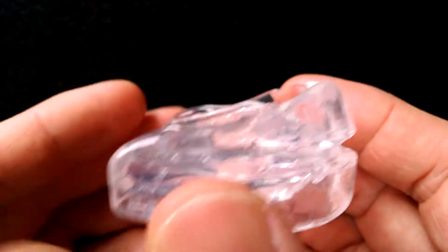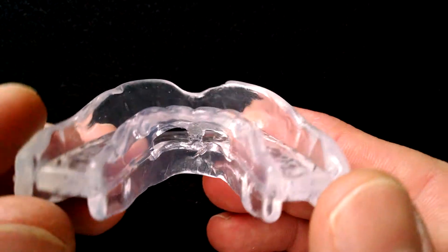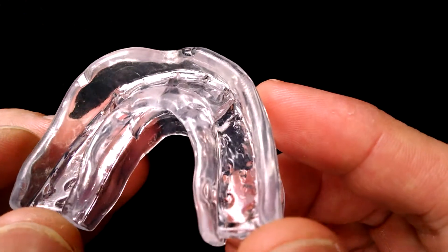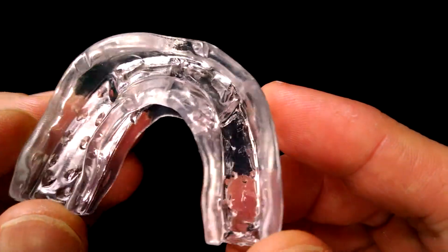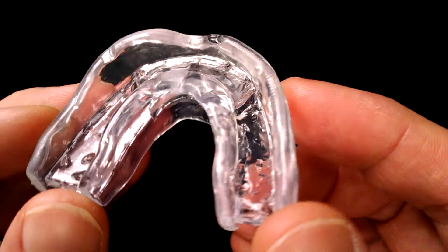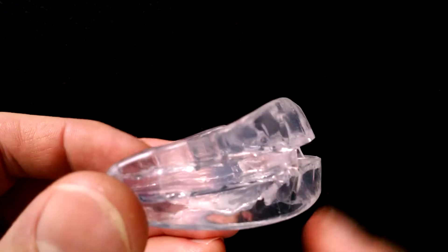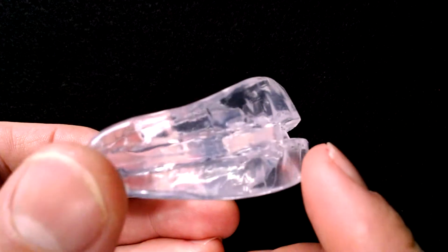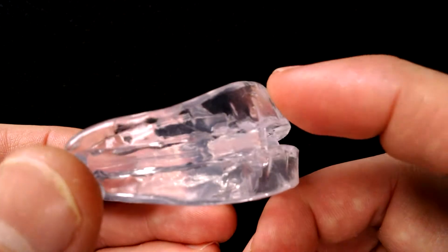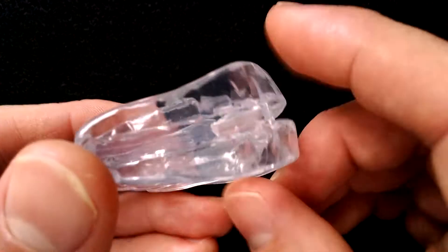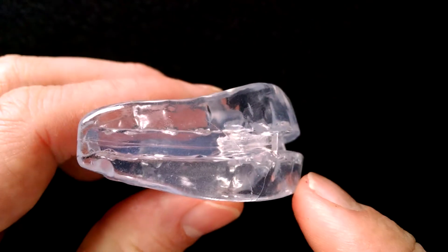The Rip Snore is a boil and bite mandibular advancement device. You can see this one has actually already been boiled and I actually use this one, and what it does is it actually holds the lower jaw forward. You can see here that the lower tray is slightly in front of the upper tray. By holding the lower jaw forward you tighten the airway and that's what prevents the snoring.